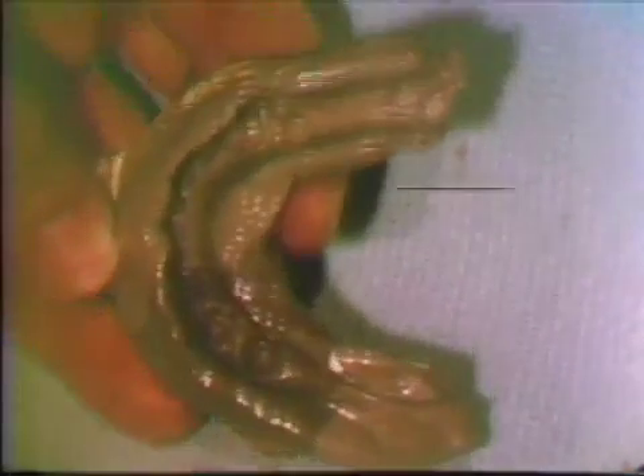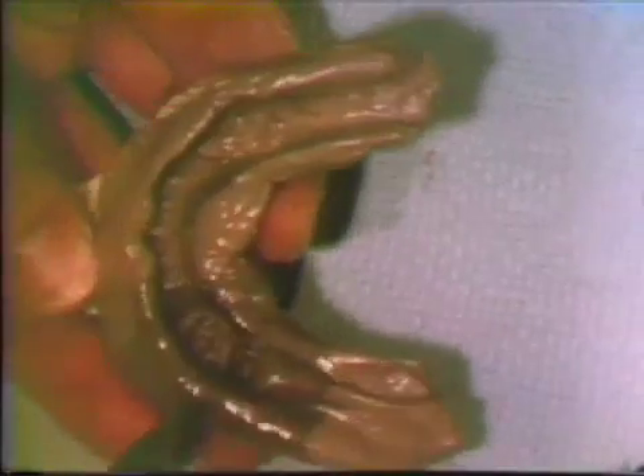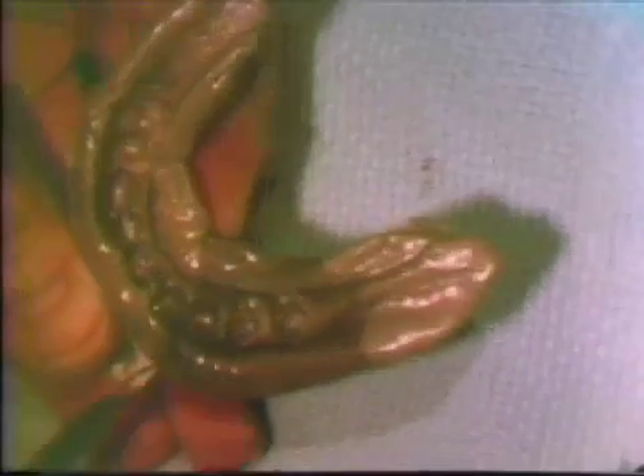After the proper setting interval, the impression is removed, thoroughly washed, dried, and inspected for accuracy of detail. A new wax occlusal registration is obtained. A working model of the tooth preparation must be articulated with the opposing maxillary cast to develop the occlusal anatomy and dimension of the replacement crown. It is extremely important that the closure into this wax registration be a controlled closure; otherwise, the patient may over-close on the prepared side. The wax wafer is removed and chilled, then reinserted for final adaptation.